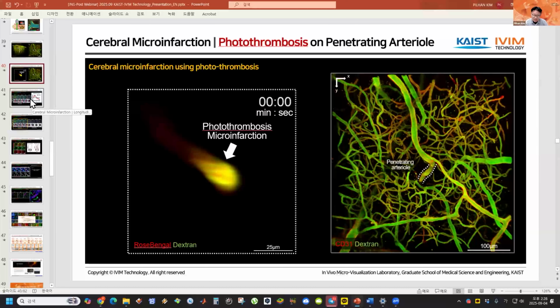Then the CD31 antibody fluorophore conjugate circulates through the full body via the vessels, and very nicely labels the individual endothelial cells, as you can see in here in red color. So it's quite simple, just a single IV injection of 10 microgram to 20 microgram of properly conjugated CD31 antibody was enough to label the full endothelial cells in the brain and the body.